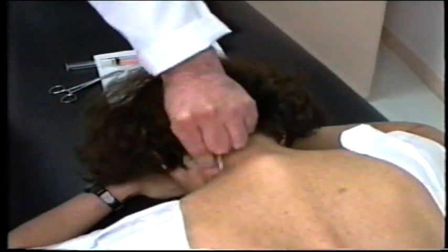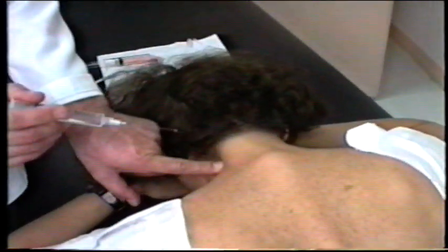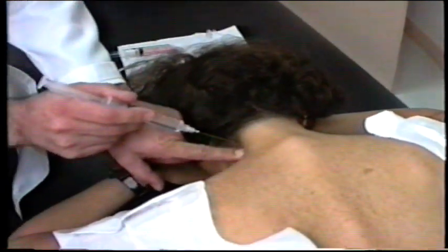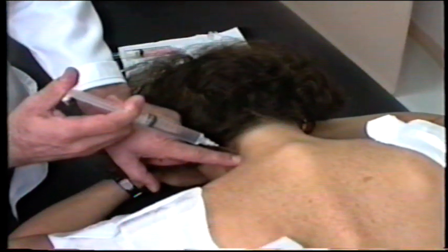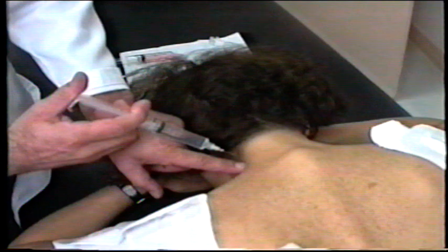So again, I'm preparing the area with the alcohol. This is the one, Jim? Mm-hmm. Alright. I'm on the transverse process at this point, at the tip of it. That's it. This is the pain. Mm-hmm. Is the pain gone?